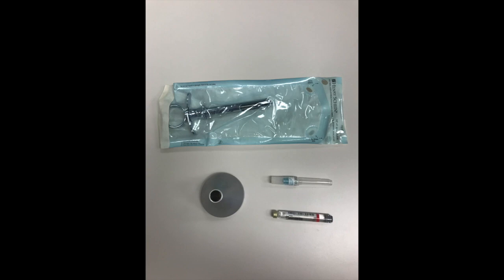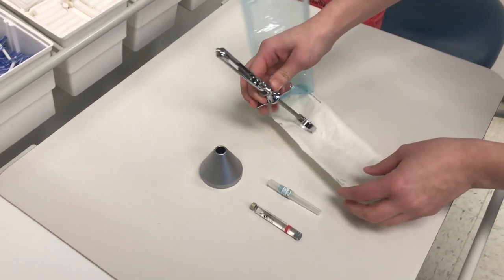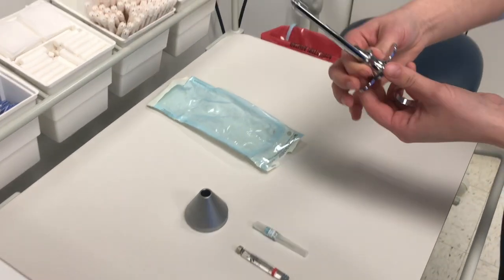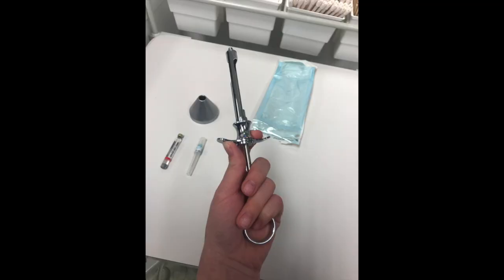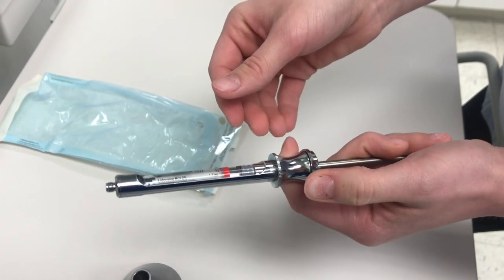Gather supplies needed. Remove the syringe from the autoclave pouch and inspect it to be sure it is ready to use. Hold the syringe in the left hand with your thumb and place the cartridge in the barrel of the syringe.